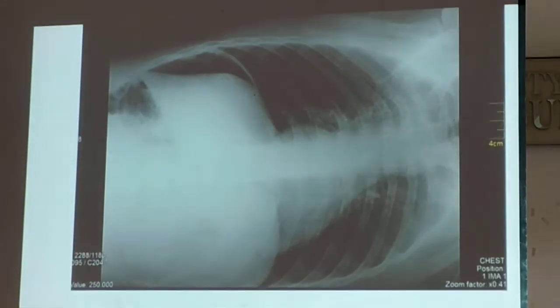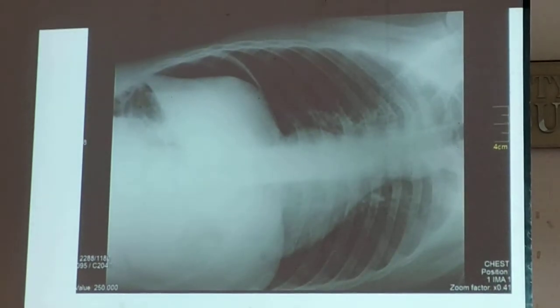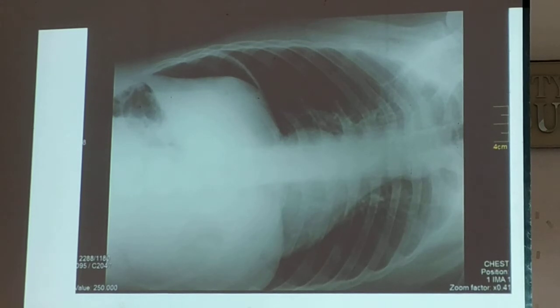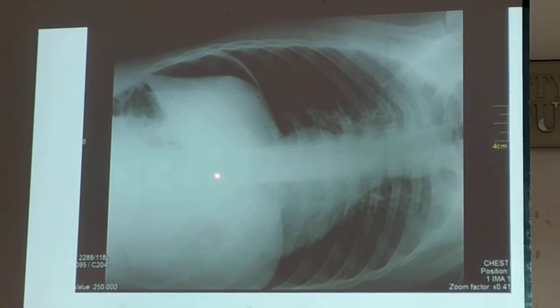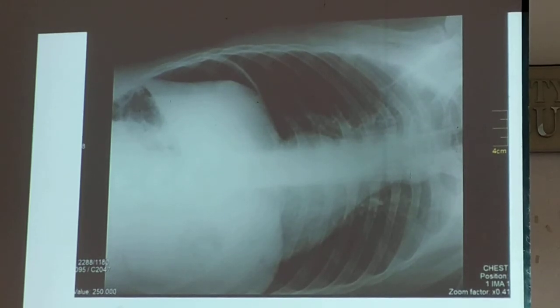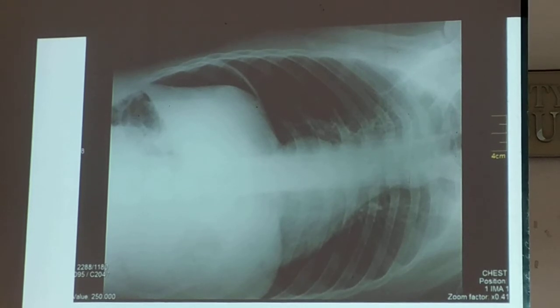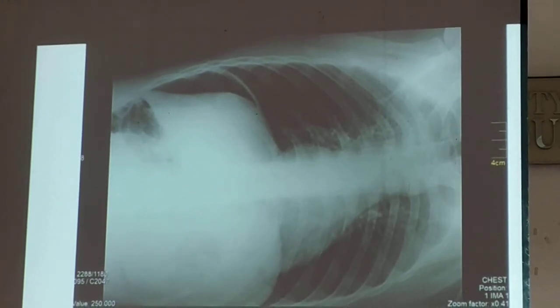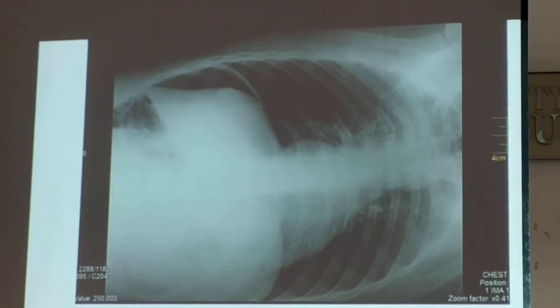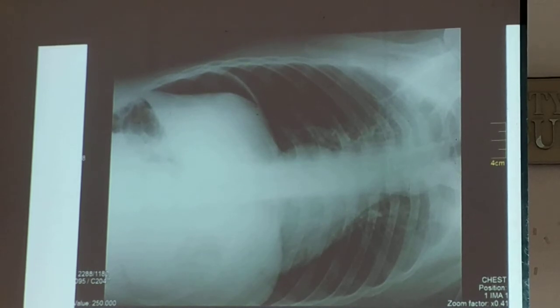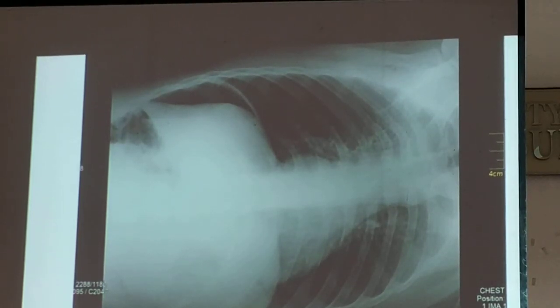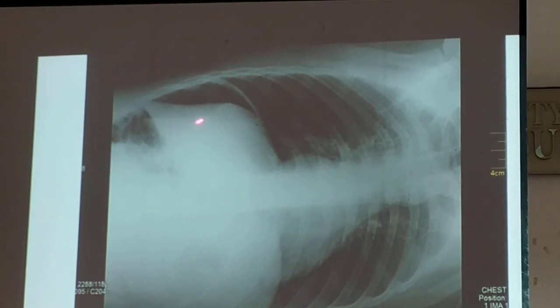Another way to establish your diagnosis of pneumoperitoneum — if the patient cannot tolerate the upright position, do the lateral decubitus film. Because as with pleural effusion where fluid settles on the dependent portion, air will always go up — it will never settle at the bottom. So this is a case of pneumoperitoneum.